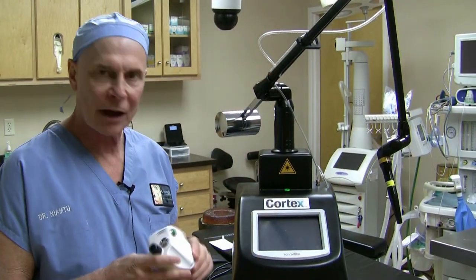We're going to use this laser for several projects. We're going to do two cases of erbium resurfacing for brown spots — one on a sedated patient, one on an awake patient. We're going to do two cases of fractional CO2 laser, again one on an awake patient, one on a sedated patient, and then we're going to use the incisional handpiece for upper and lower. This is a really versatile machine.